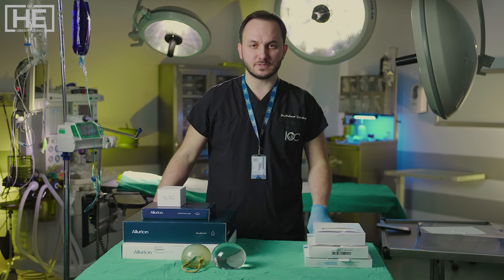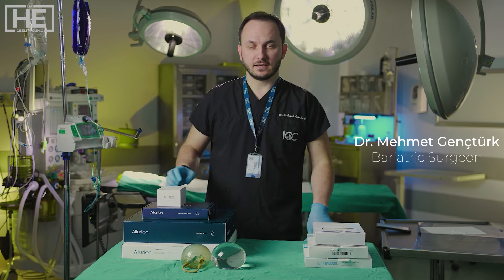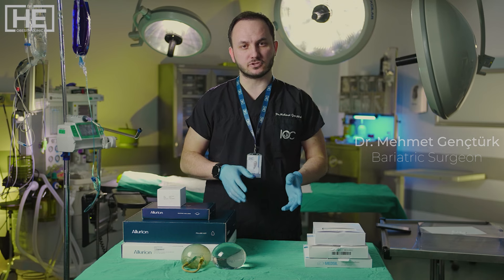Hi everyone, I'm Dr. Mehmet from Dr. HE Clinic. Today I want to give some information about gastric balloon types.